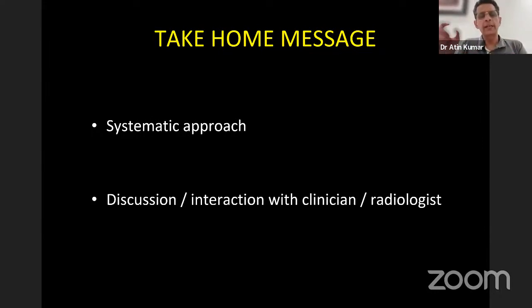It can prognosticate, but the acute changes cannot be picked up later on an MRI. The diffusion weighted changes are seen up to 7 days only, maximum 10 days. If you do MRI after 10 days after the insult, there will be no changes on diffusion. Then you cannot time it. You cannot tell when it happened. You can just tell there were some chronic changes which have happened.